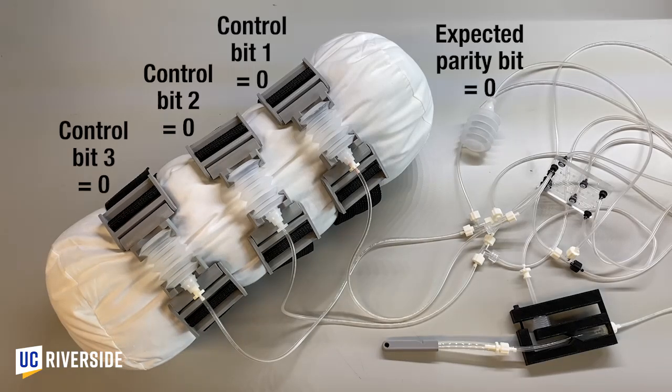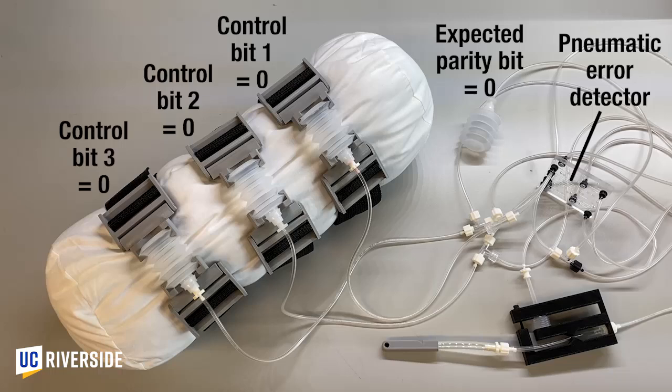The 3 pneumatic lines for the control bits and the 1 pneumatic line for the expected parity bit are also connected to our pneumatic error detector, shown here. This device uses monolithic membrane valves and pneumatic logic to calculate the parity bit from the values of the 3 control bits, and compares this calculated parity bit to the value of the expected parity bit. If the 2 parity bits match, then the pneumatic error detector outputs 0 or atmospheric pressure on its error output. However, if the 2 parity bits are different, then an error has been detected and the device outputs 1 or vacuum on its error output.